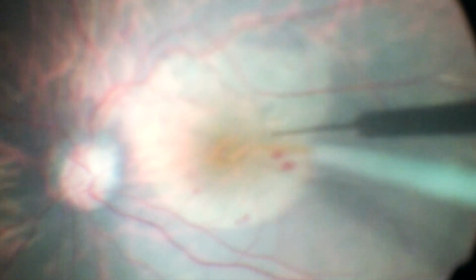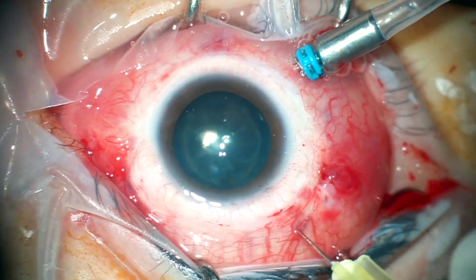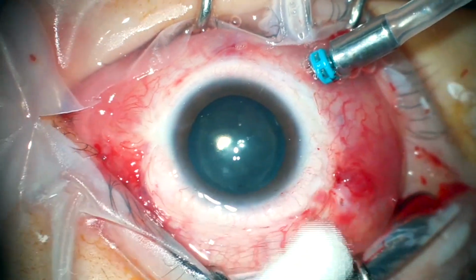The surgery is finalized with a fluid-air exchange, and non-expansile concentration C3F8 gas is placed at the end of the surgery.